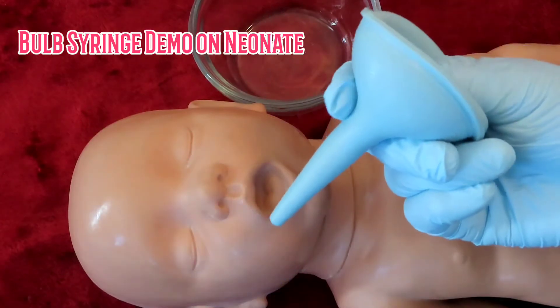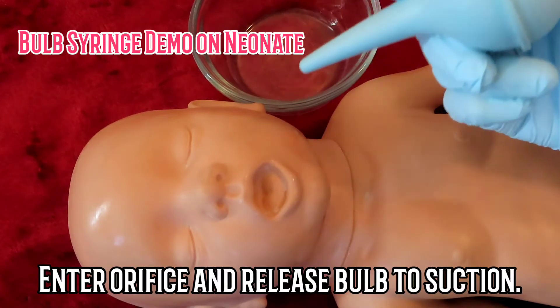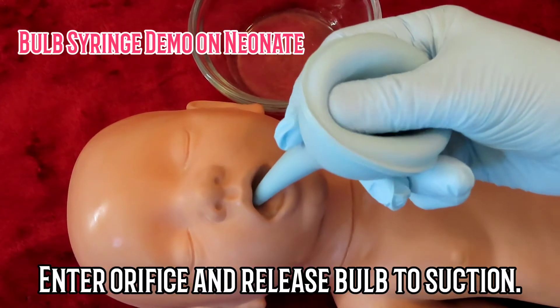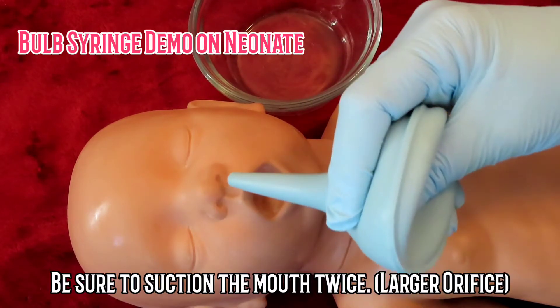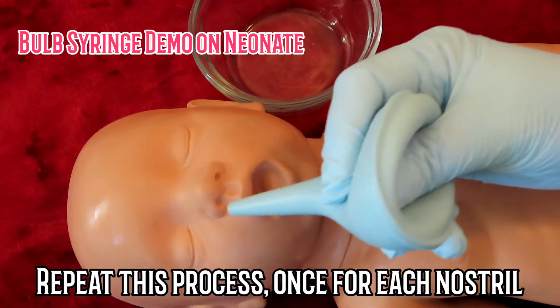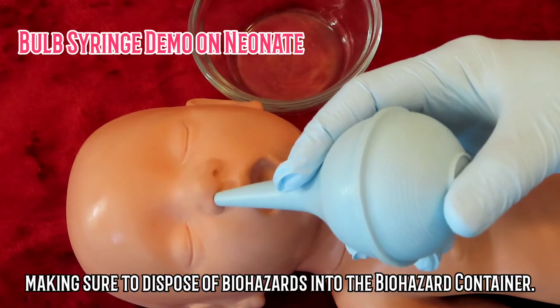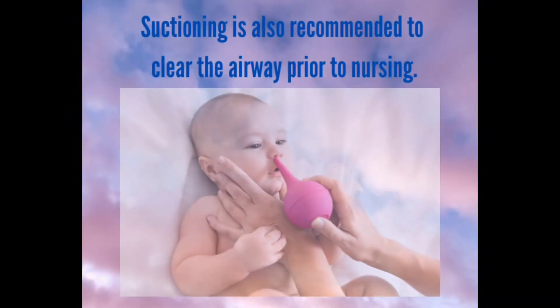Bulb syringe demo on neonate: squeeze the bulb before entering the orifice, enter the orifice and release the bulb to suction, then squeeze the bulb to dispose of fluids in a biohazard container. Suction the mouth twice since it is the larger orifice, then repeat once for each nostril, disposing of biohazards properly. Suctioning is also recommended to clear the airway prior to nursing.